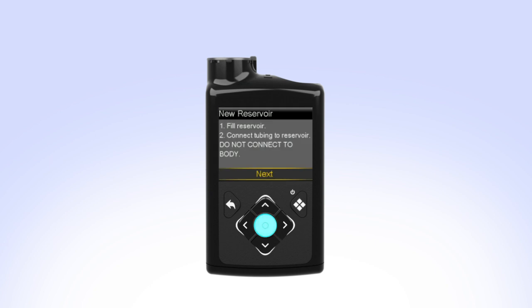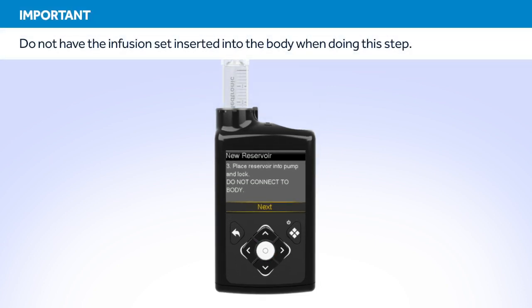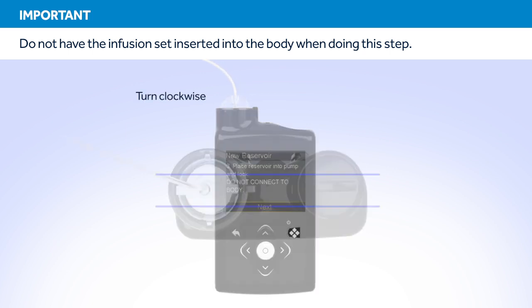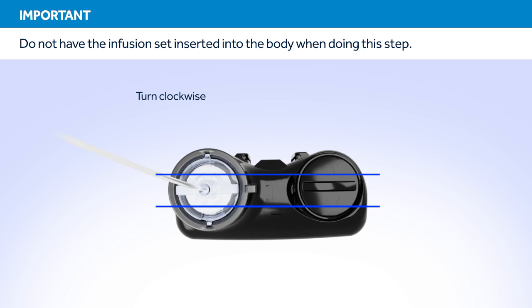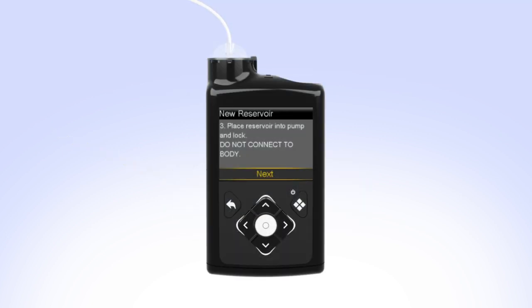Select Load Reservoir from the menu. The New Reservoir screen appears. Since you have already filled the reservoir and connected the tubing, select Next. Put the reservoir in the pump and turn the tubing connector clockwise until you feel the reservoir lock into place. The tubing connector should line up with the groove in the battery cap of your pump. On your pump, select Next to go to the Load Reservoir screen.